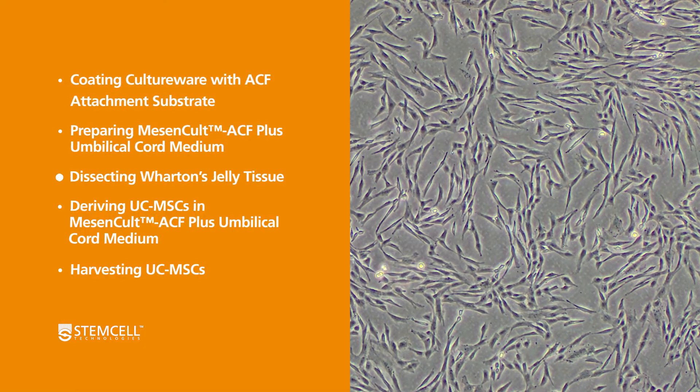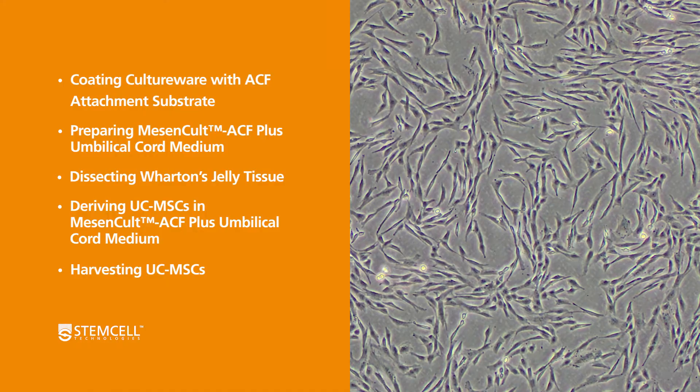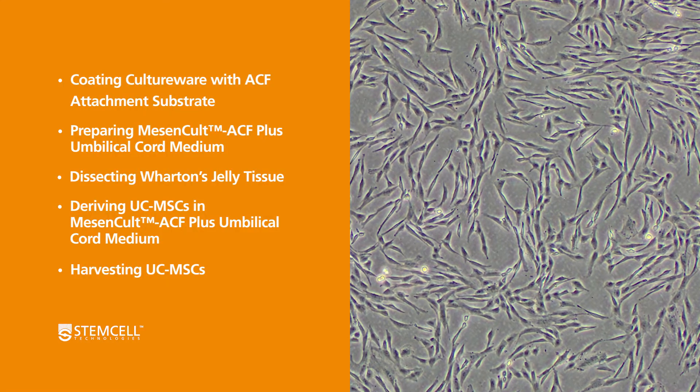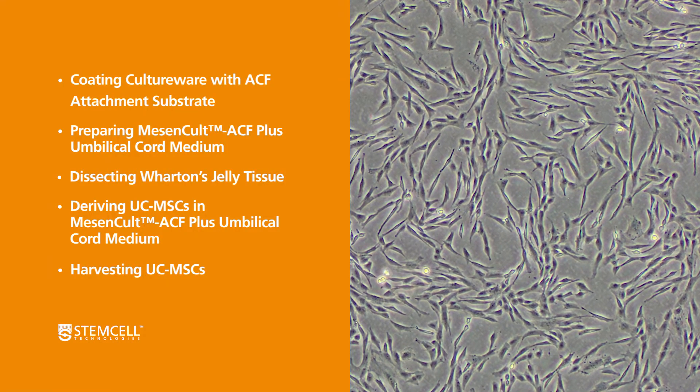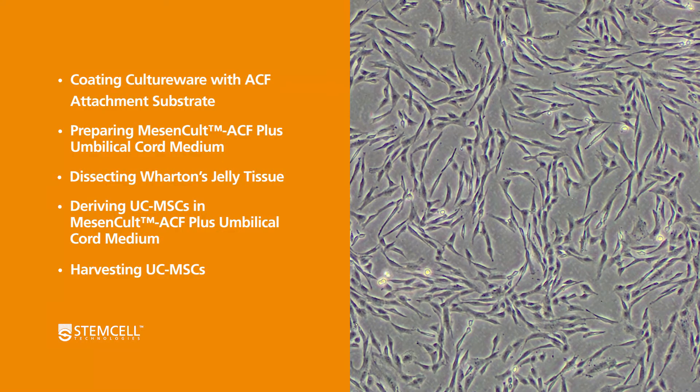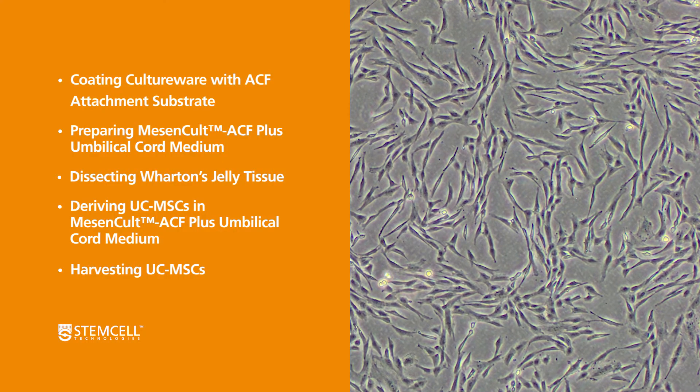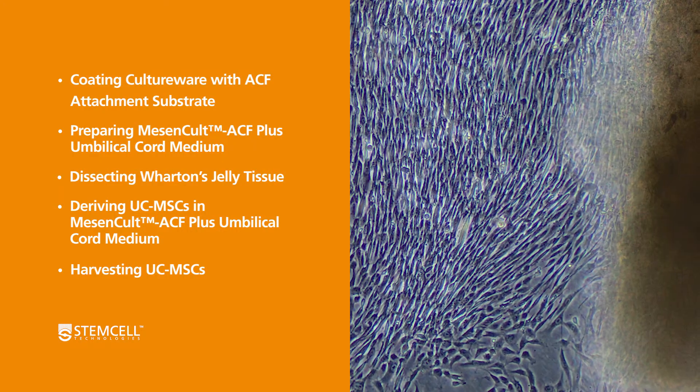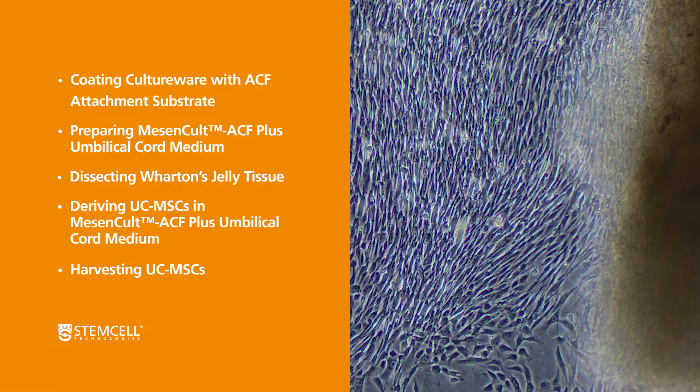This video will describe how to prepare the culture wear and medium, dissect the umbilical cord, and derive the MSCs using the MesenCult ACF Plus Umbilical Cord Kit by plating into a single T75 flask and passaging the derived cells for the first passage.